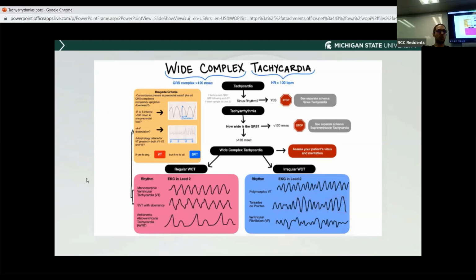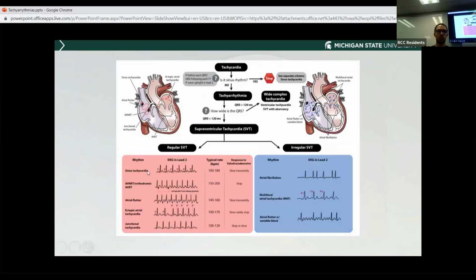Regularly, a patient with just a sinus rhythm can still have a wide complex because of an underlying bundle branch block. The reason, as we mentioned, is that there is a delay in one of the Purkinje fibers, right or left, or one of the fascicles. So if this right bundle branch block in a sinus rhythm transitioned or converted into one of these, for example regular SVTs, you have a regular SVT but with an underlying right bundle branch block.